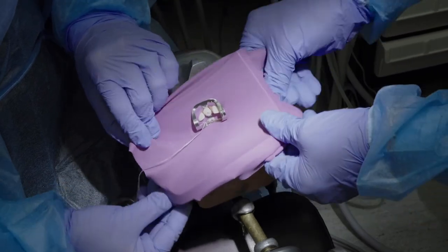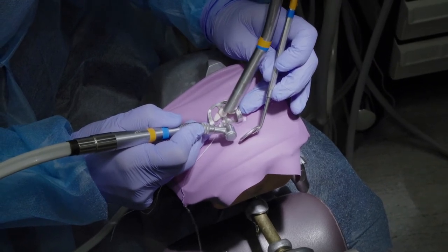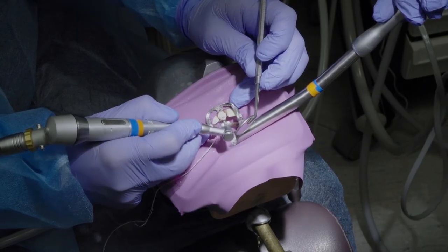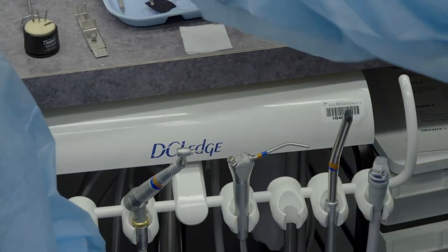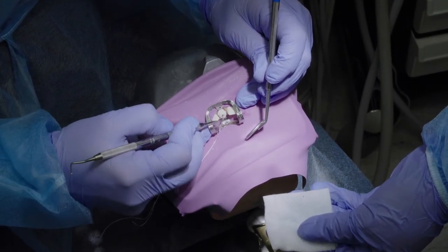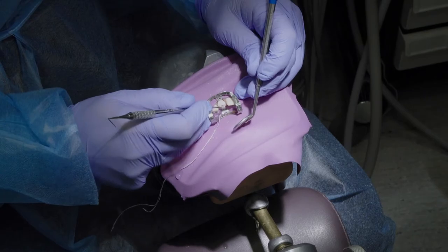The dentist is now going to use the friction grip round burr, followed by the latch round burr. The assistant will pass the spoon excavator with a 2x2 in the transfer zone. Next to pass is the endodontic explorer. The dentist is locating the opening of the canal.